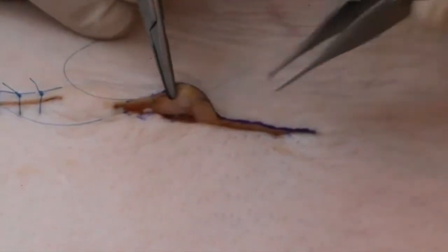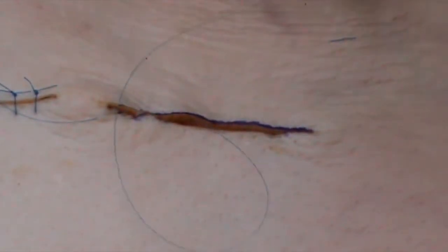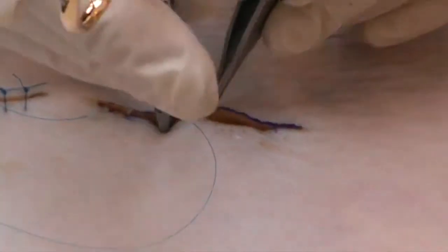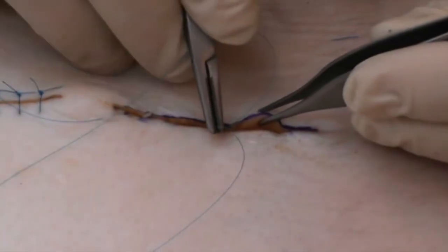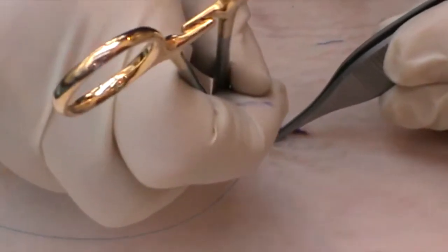So here we go again — slightly too deep on that side. You want to ensure that you mirror the depth of the run of the suture from side to side. And you can see how that's coming together very nicely. The potential disadvantage of this wound closure is that as the suture is no longer interrupted, the wound is effectively sealed and if there is any bleeding, it won't be able to escape out between the interrupted sutures. But you can see the way in which this brings the wound together without tension, because you've already put your deep or buried sutures into the deep layers to take the tension away from the skin.